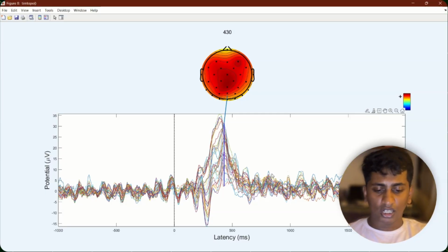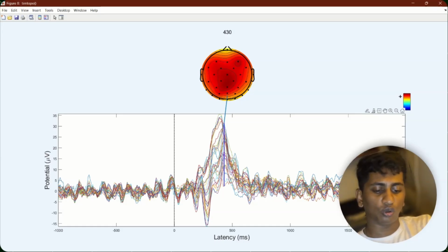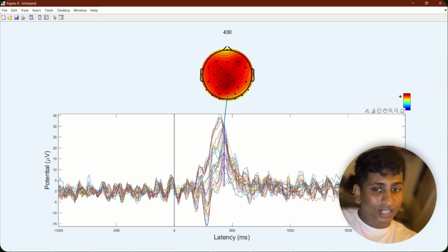Basically, you convert it to dB, apply a color map, and use pre-trained convolutional neural networks, augmented by small time by frequency shifts, using Gabor filter banks or 2D wavelet filters. We need this because it makes localized patches in the image visible, and CNNs are excellent at picking up such localized patches.